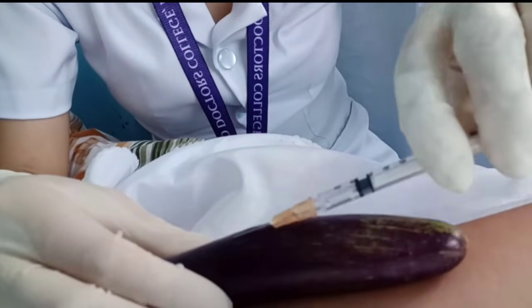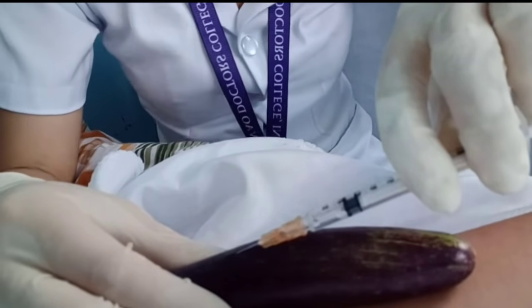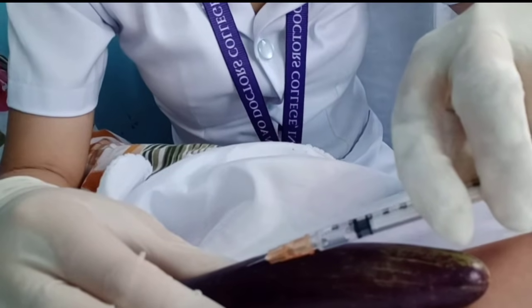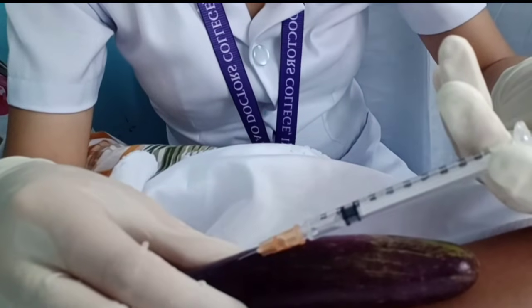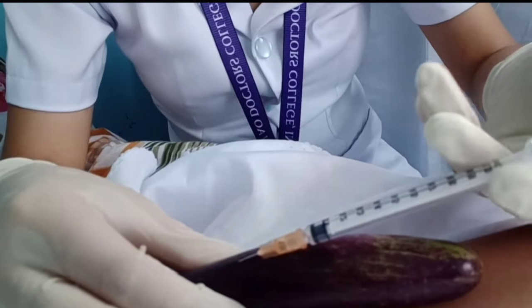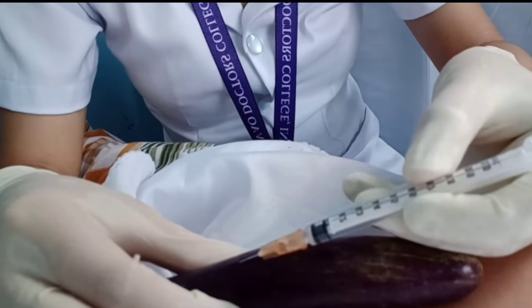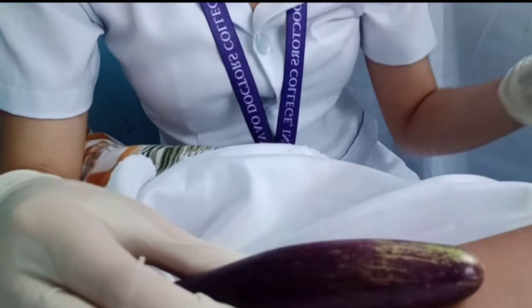Insert slowly at a 5 to 15 degree angle until resistance is felt. Advance the needle up to the epidermis 3 millimeters and slowly inject the medication until you see a bleb resembling a mosquito bite appear on the patient's skin. If a wheal appears, it means that all the solution is in the intradermal tissue. Now withdraw the needle at the same angle it was inserted to minimize tissue damage and discomfort for the patient.